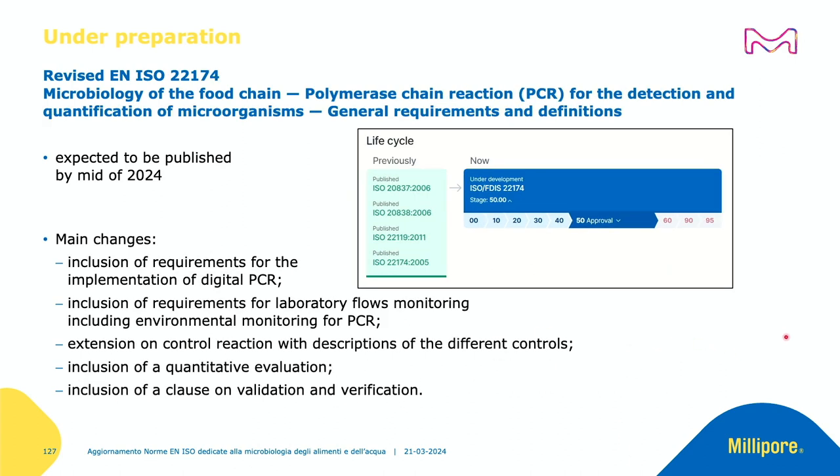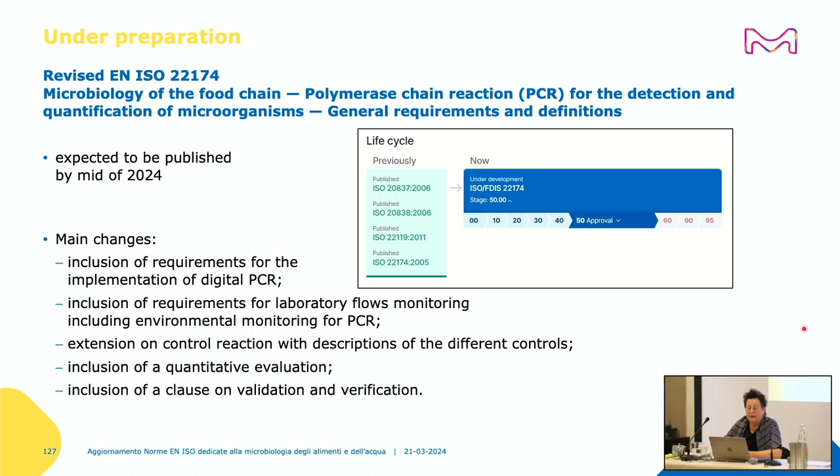Then I have seen that EN ISO 22174, general requirements and definitions for the PCR for the detection and quantification method, has also been cited. Yes, I was very happy to see. This has been revised. It was also a long process. It will also be published by mid of the year, maybe more July or August.